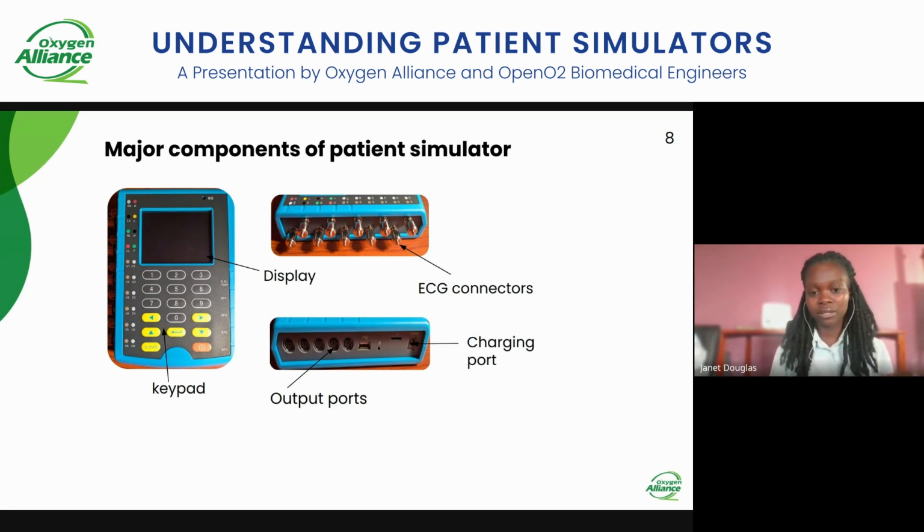Every simulator also has a charging port, because they use rechargeable batteries. And you can also have other outputs. On the output ports, you can connect other parameters, like body temperature, or if you want to assess non-invasive blood pressure. These are the ports you use to connect those probes.